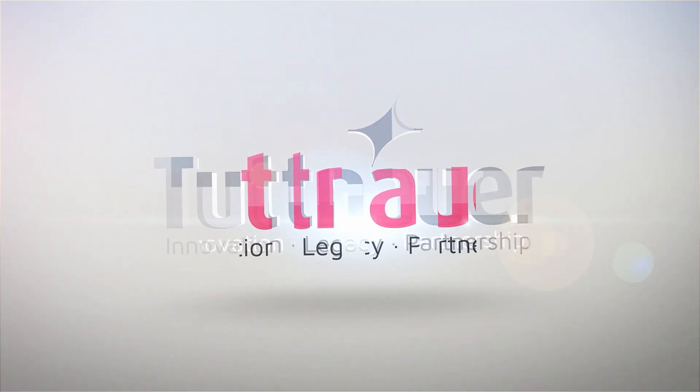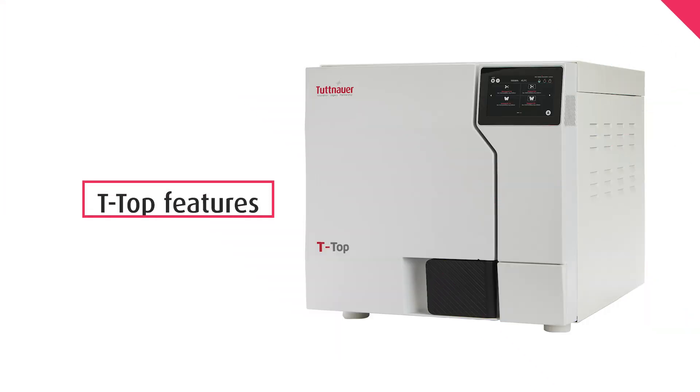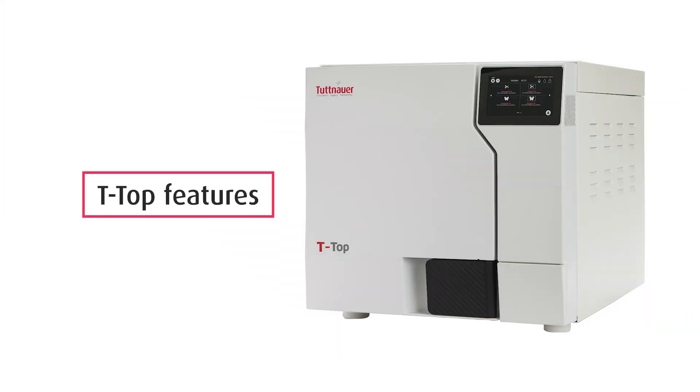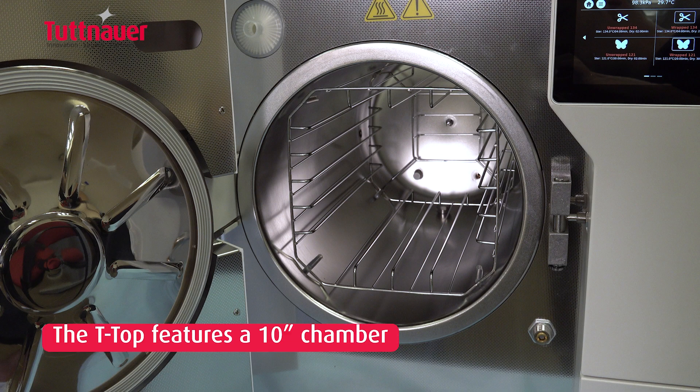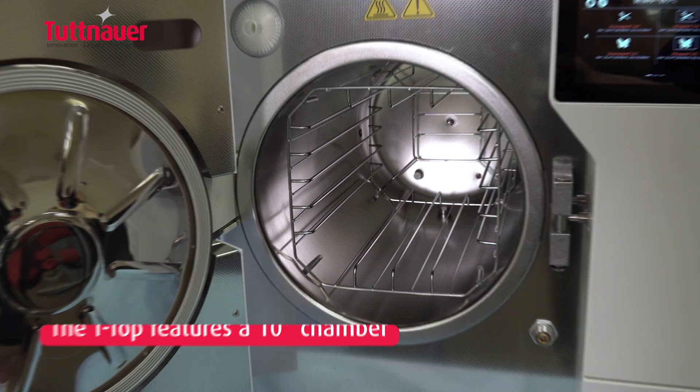In this video, we will demonstrate the key features of the T-Top autoclave. This autoclave is the perfect fit for small to medium-sized healthcare clinics, with all the features your clinic needs to sterilize your instruments safely. The T-Top features a 10-inch chamber which can handle the most demanding loads of your clinic.